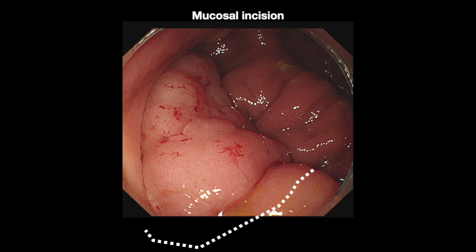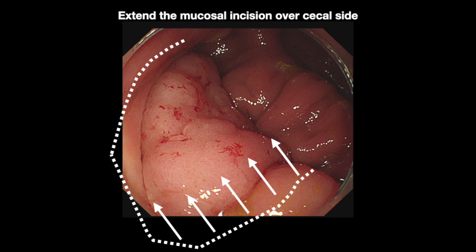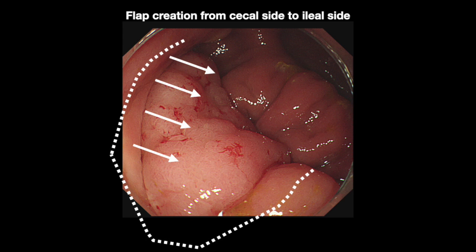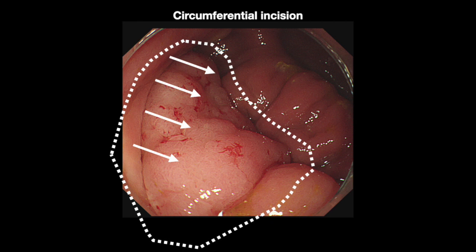Then we extend the mucosal incision over the cecal side. Flap creation can be done from the cecal side to the ileal side. Finally, we perform whole circumferential incision and complete the dissection.